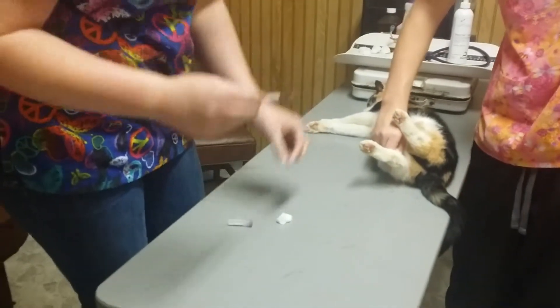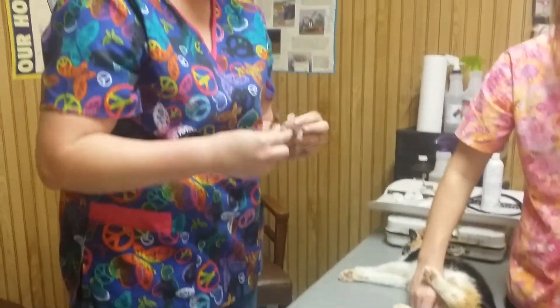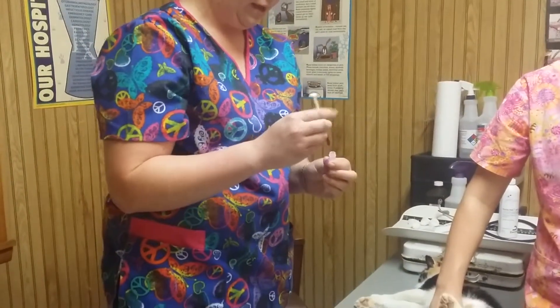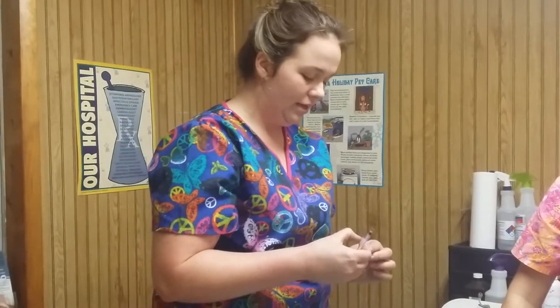And I'm going to put the blood in the properly labeled tube. And that is how you perform a medial saphenous venipuncture on a feline.